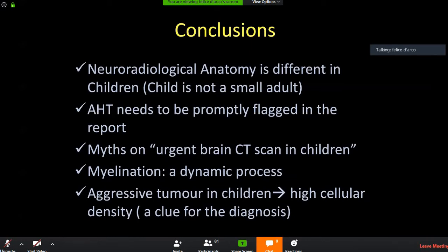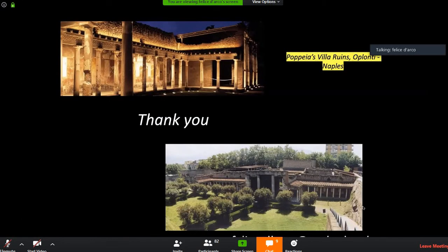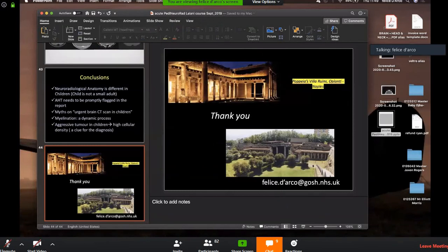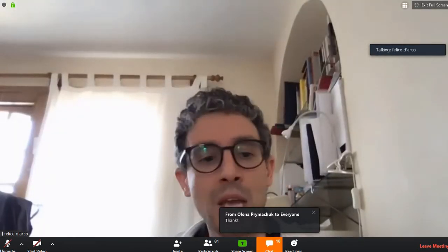In conclusion: neuroradiological anatomy is different in children — a child is not a small adult. Non-accidental injury must be promptly flagged in the report with the right imaging protocol. Do not use urgent brain CT for all children — involve the neurologist. Myelination is a dynamic process. Aggressive tumors in children show high cellular density — this is a key diagnostic clue.